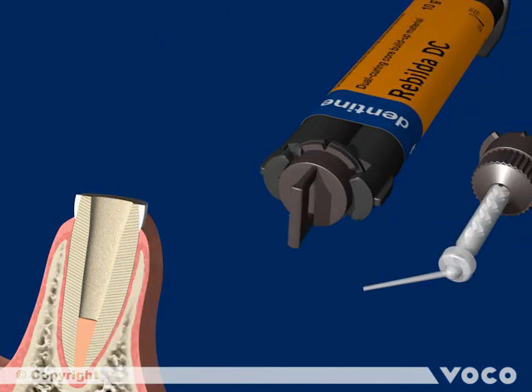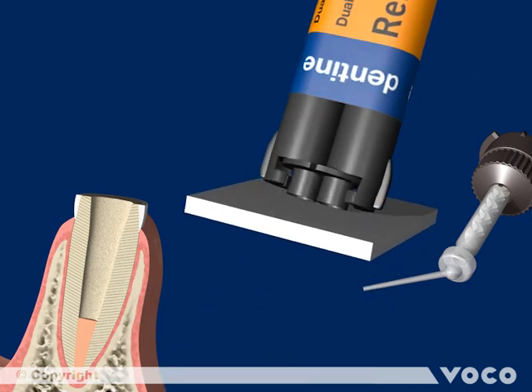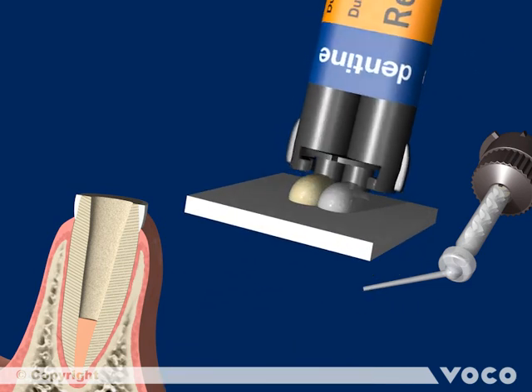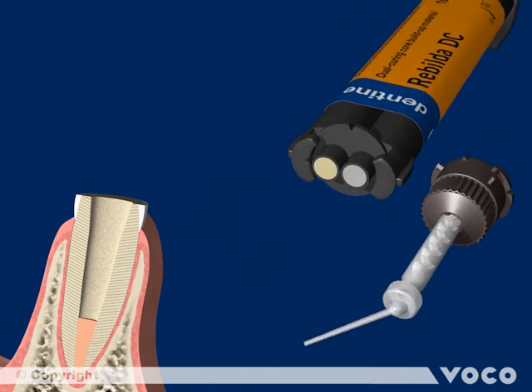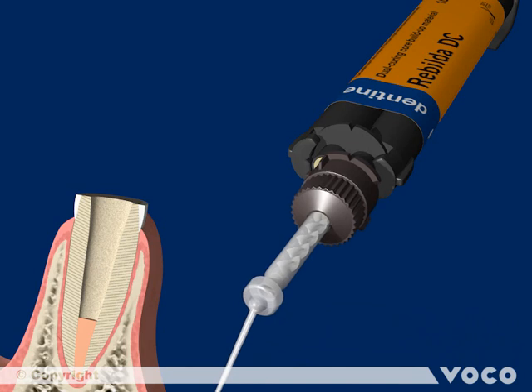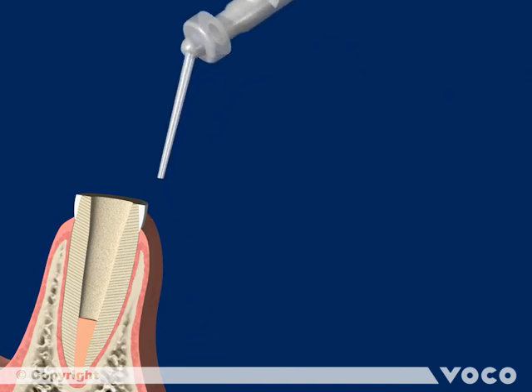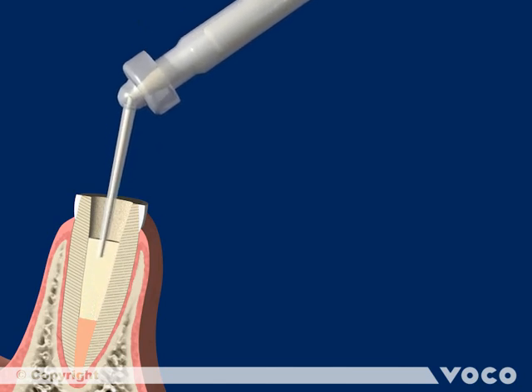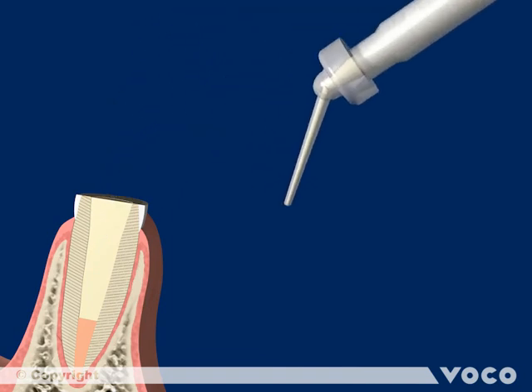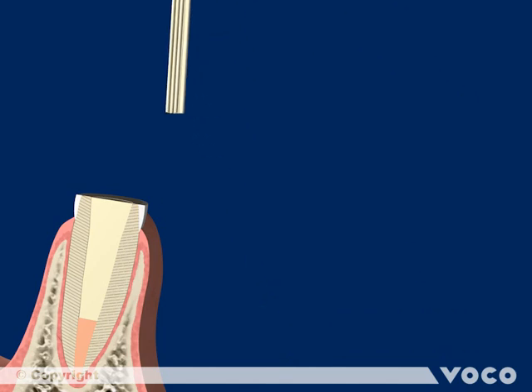Rebilda DC is a dual curing composite for luting root posts and for core build-up. Before using it for the first time, both chambers have to be equalized by pressing out a small amount of material without the mixing tip attached. The mixing tip with an attached Endo-Cannula is now fitted and locked to the syringe by a quarter-turn right. The root canal must now be completely filled with Rebilda DC, then completely cover the Rebilda Post GT and place it directly into the root canal without delay.